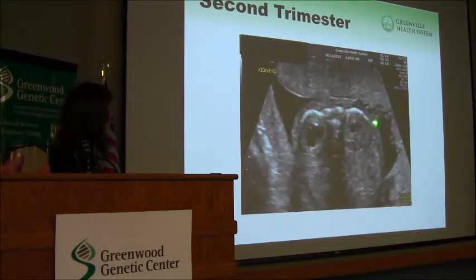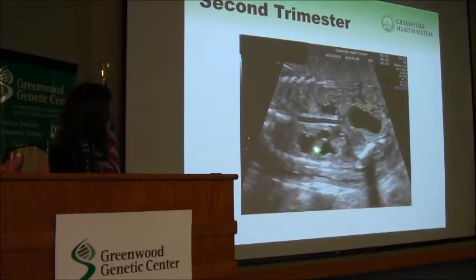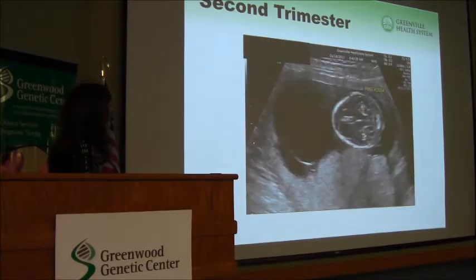These are a cross-section of the fetal kidneys, and you can see the renal pelvises are dilated here, as you would see in hydronephrosis. So reason for hydronephrosis, we've got what's called a keyhole appearance to the bladder, where there's a bladder outlet obstruction. And when we see these, we can actually tap the fluid in the bladder to see how the kidneys are functioning. And if they're still functioning well, we can actually put a shunt here and allow fluid to leave the bladder during fetal life, allow pulmonary maturation from amniotic fluid being normal, and then this can be corrected postnatally.